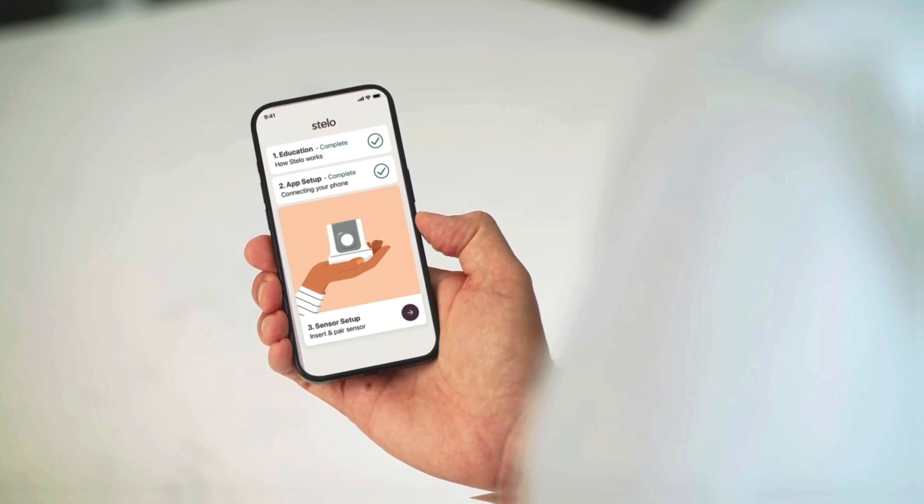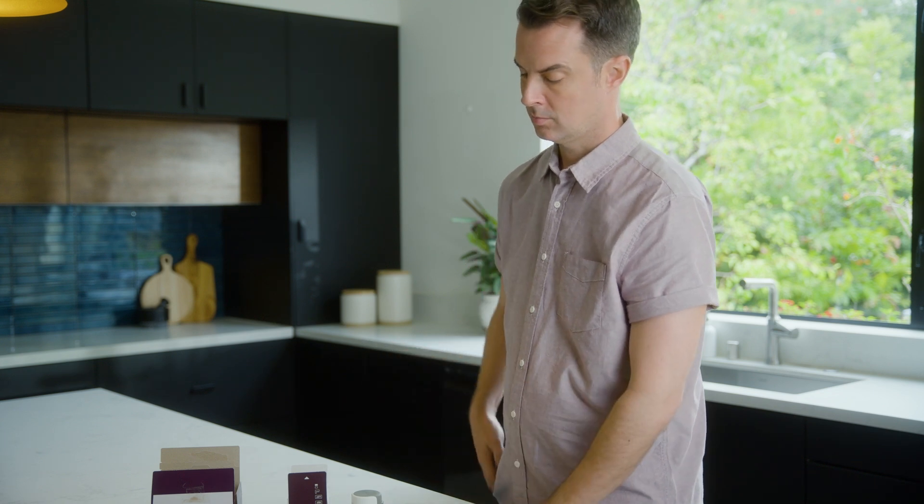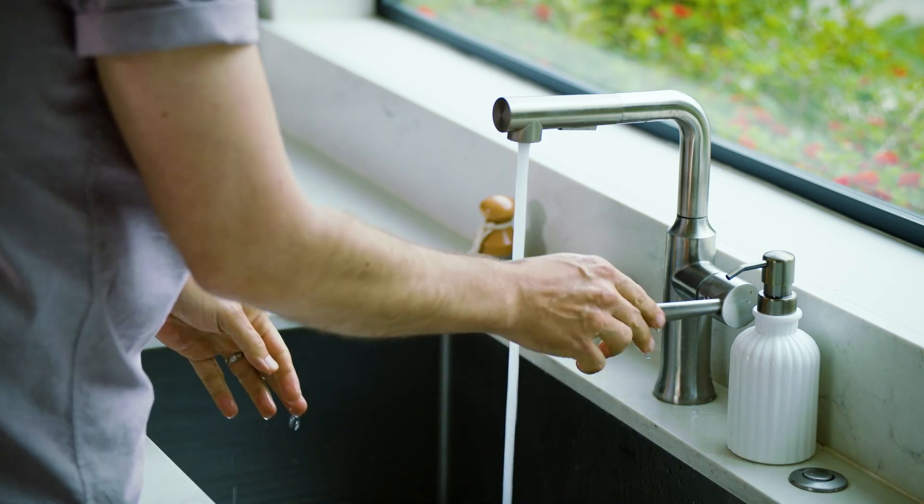Then, the app provides instructions on how to insert your sensor. Let's walk through how to get your sensor inserted and apply the overpatch. You can also find directions for this in the app.